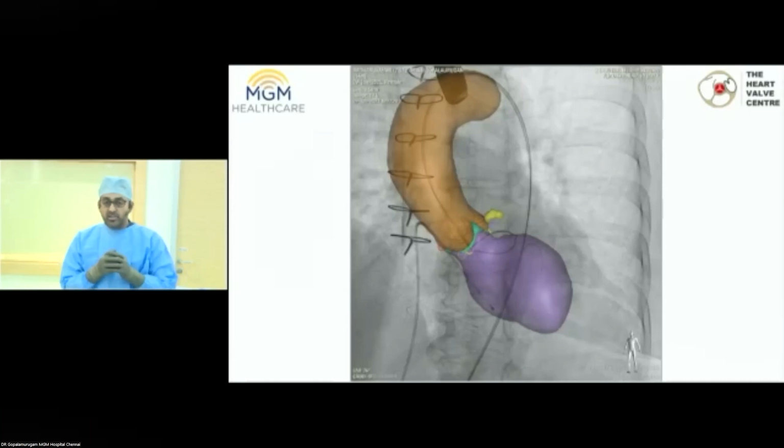And it's not a barbaric pull, it's going to be a neat cut because we're going to do an electrosurgery, not rip it off. And how do we do that? We have two catheters, one in the LV with a snare and one in the aorta, an AL1 with a microcatheter and an Astato wire. We're going to show the setup very, very shortly.